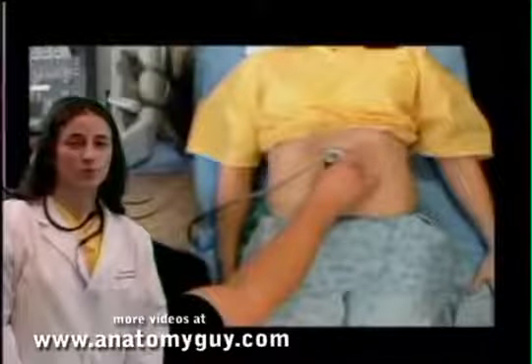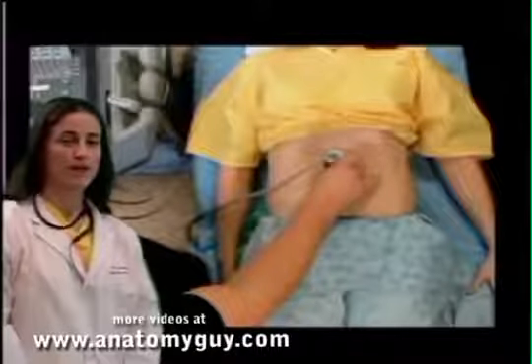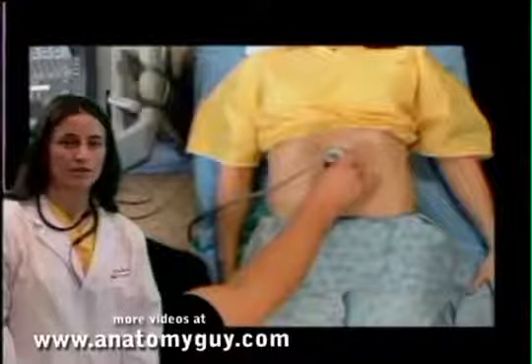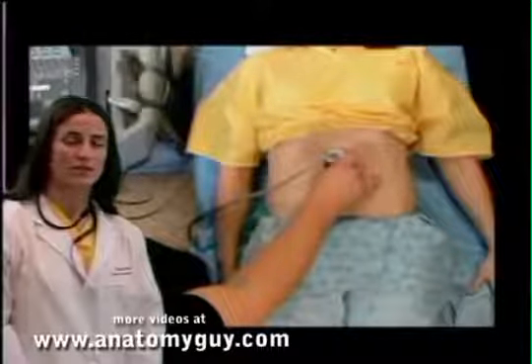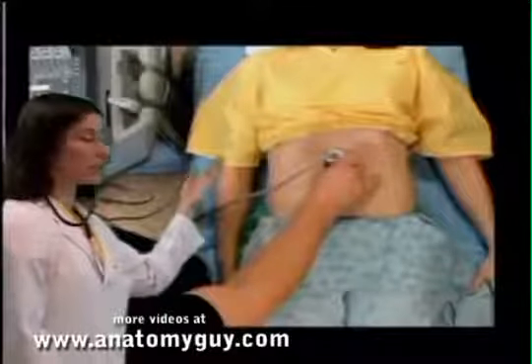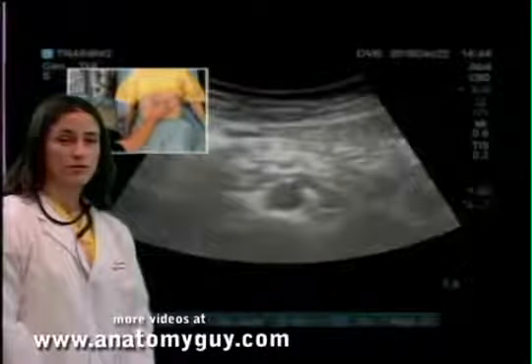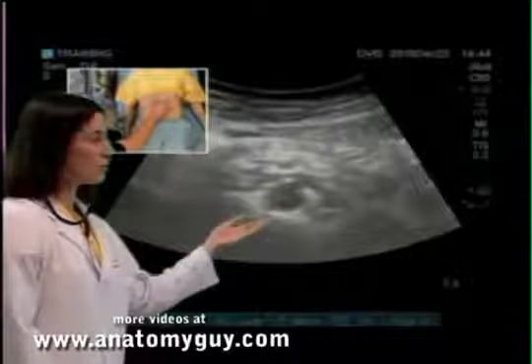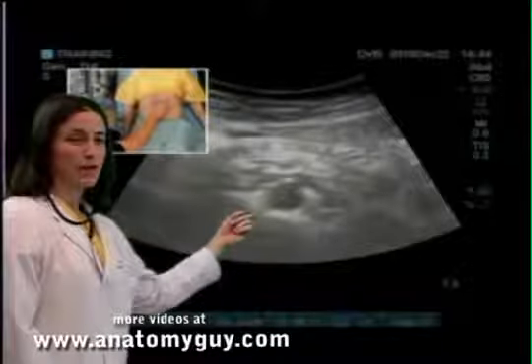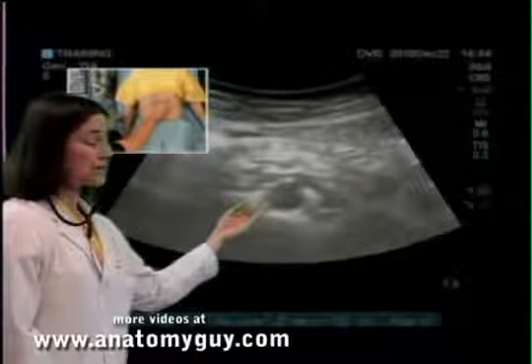After our longitudinal views of the aorta, we want to scan back up towards the patient's head. We're still left of the umbilicus, and we're going to turn our probe marker 90 degrees to get a transverse view. The probe marker here is going to be onto the patient's right side. Now we'll scan to the image on our ultrasound screen. We have here frozen, just to orient us, down here is going to be the spine. This hypoechoic or black structure is the aorta.